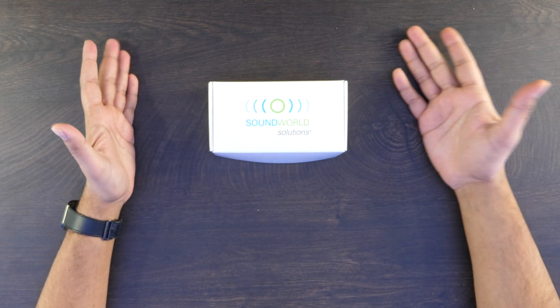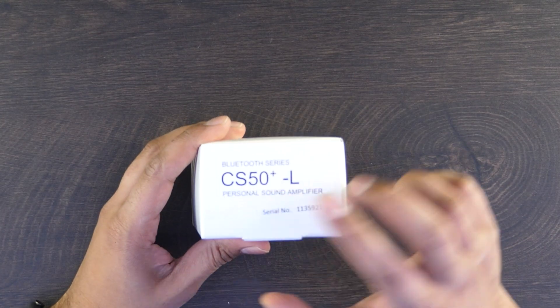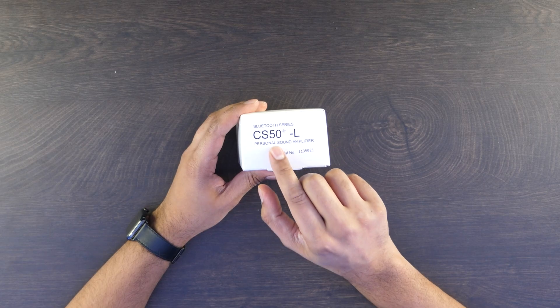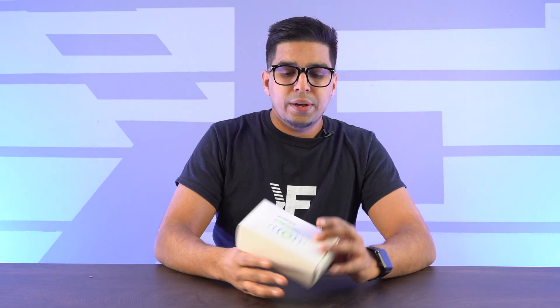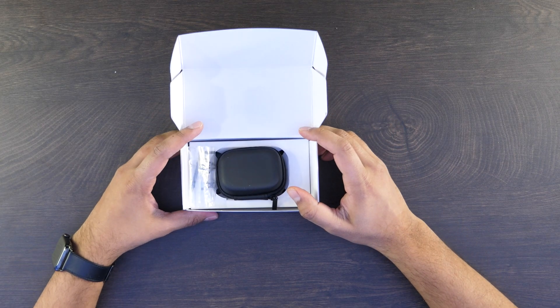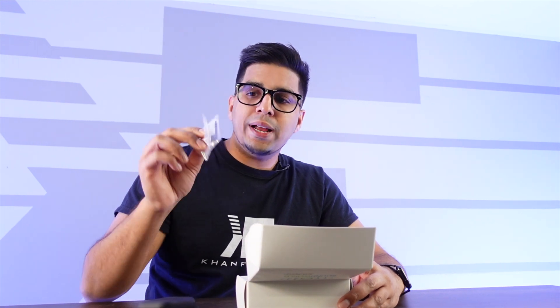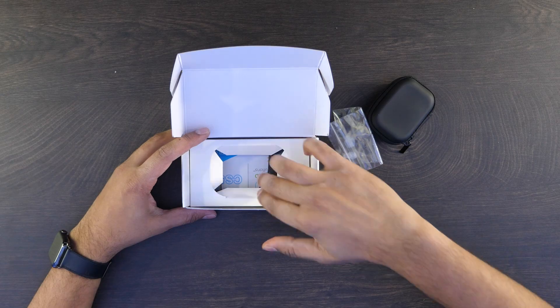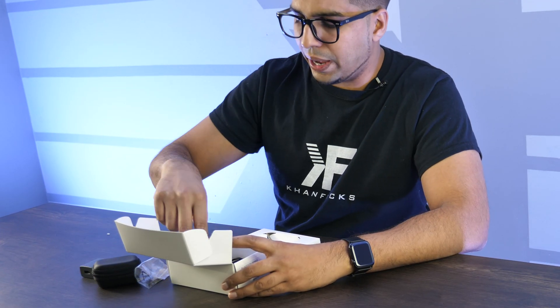All right, so this here is the packaging — the box you get. It says Sound World Solutions, and as we rotate it, this says it's the Bluetooth series CS50 Plus L personal sound amplifier. Now let's open it up. Inside here you have your little case — the ear pieces are in here — and then we have a few accessories. Looks like we have a brush as well as extra ear pieces. Below it we have a USB power block, so it's nice that they include that.